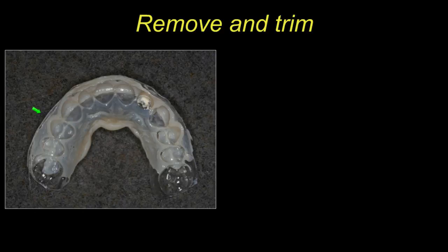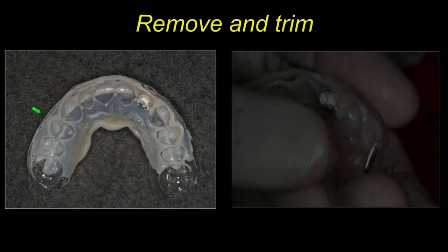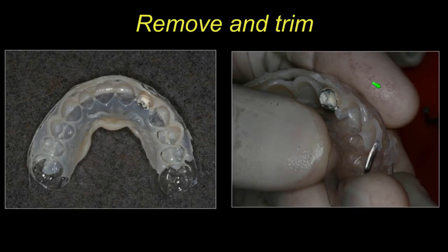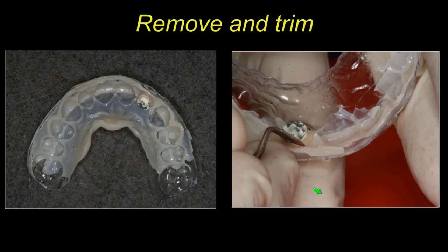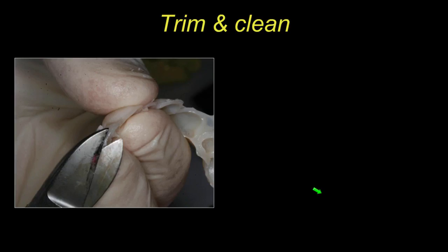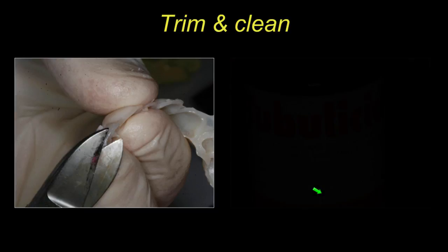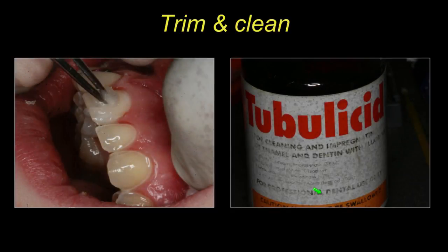While the provisional is fully setting, I take an instrument and start cleaning off all the flash — in this case a T3 instrument. I clean off as much excess flash as possible. Once three to four minutes have passed, it's stable and past the expansion phase, so I can start trimming it further. I then clean the tooth. This is the shrink wrap technique I learned from a prosthodontist mentor in the States — he's published it, and I've also written an article on it.